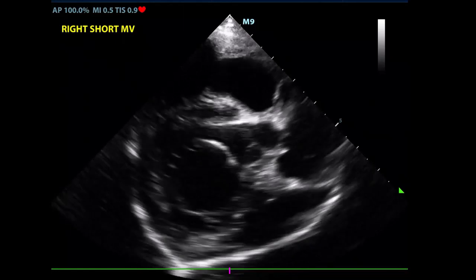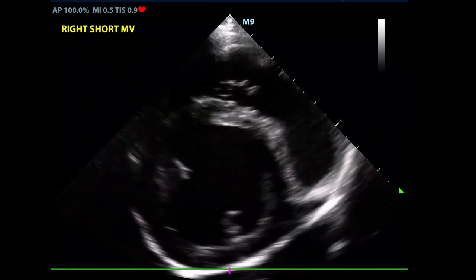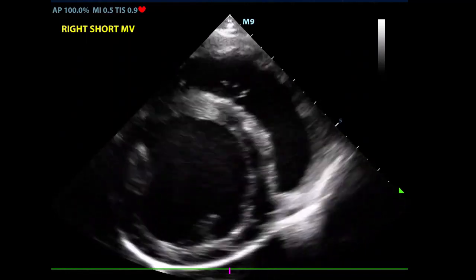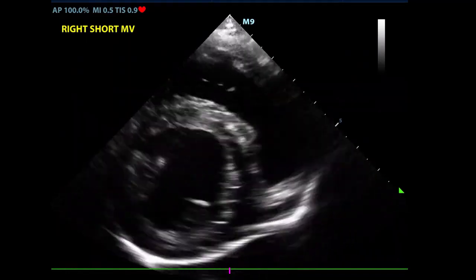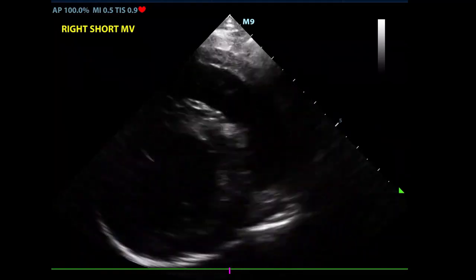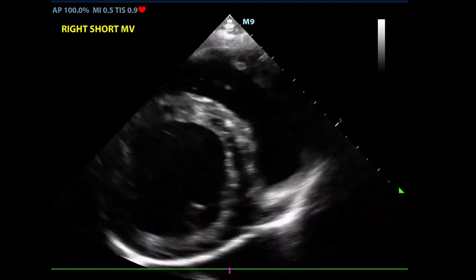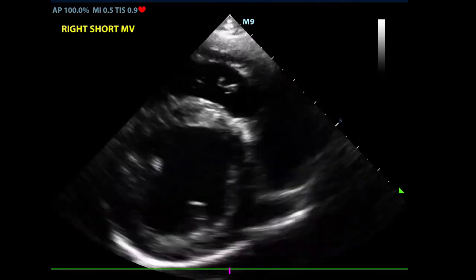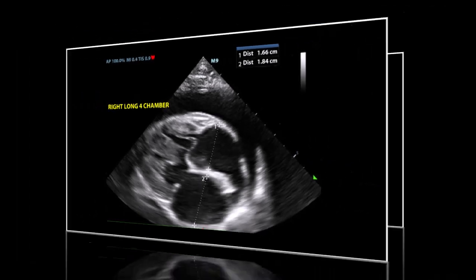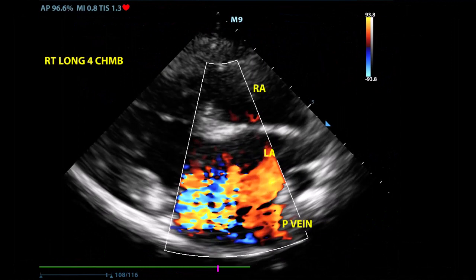As veterinarians, we use cardiac ultrasound as an imaging tool for diagnosing and staging cardiac disease. We use a number of standard cardiac ultrasound views to make observations and measurements to determine cardiac function, dysfunction, and cardiac remodeling. The information gathered allows us to diagnose and formulate or adjust treatment for the individual patient.